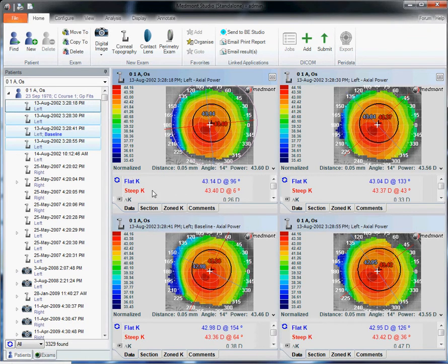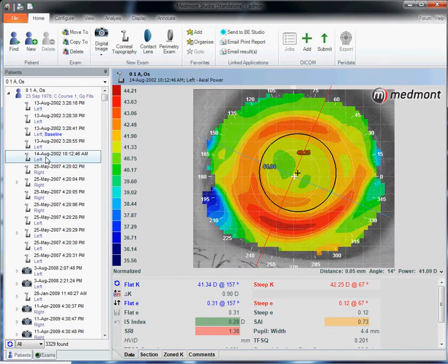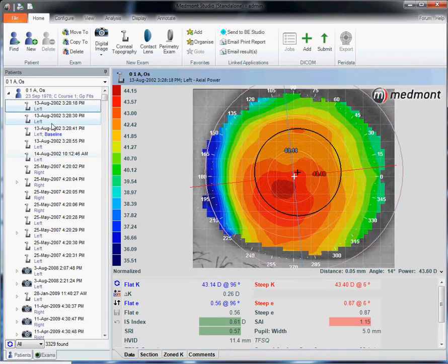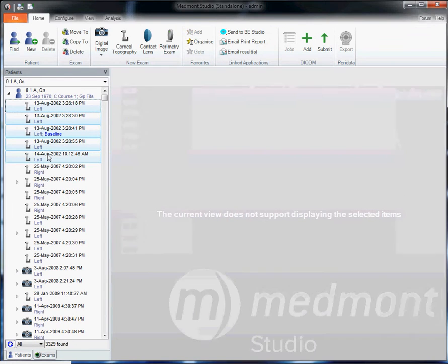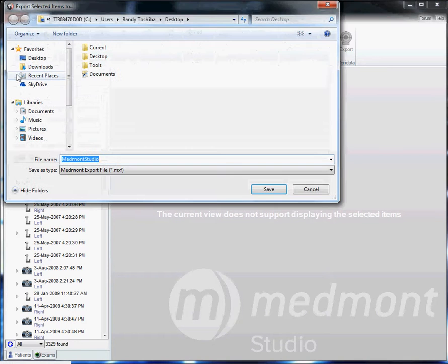If you have more than four maps to send, make sure any additional maps that you want to export, you've converted to a colorized image. Then you can highlight them all together. Go up to file and export.